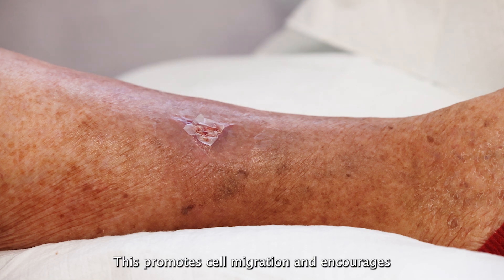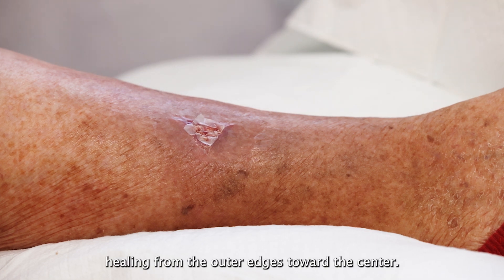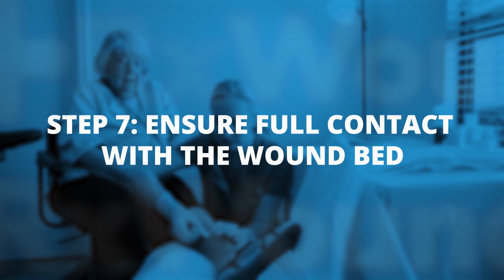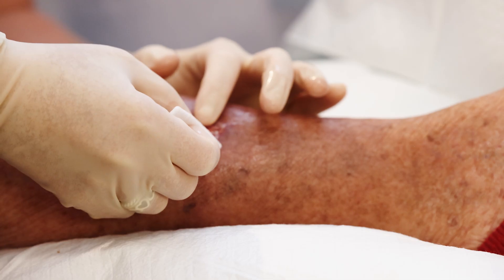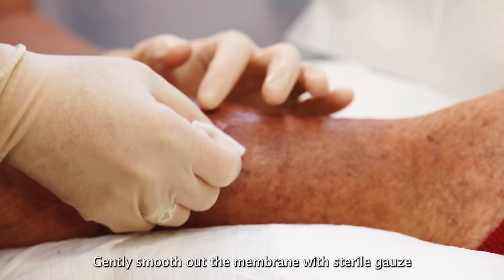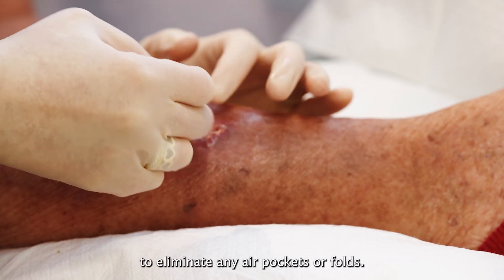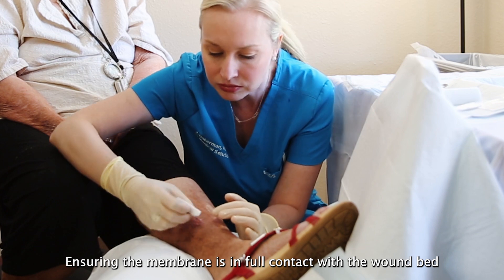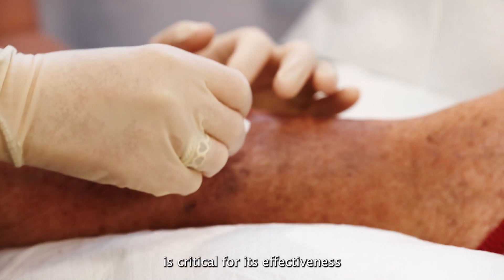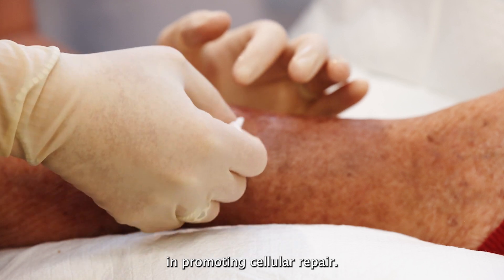This promotes cell migration and encourages healing from the outer edges towards the center. Step 7: Ensure full contact with the wound bed. Gently smooth out the membrane with sterile gauze to eliminate any air pockets or folds. Ensuring the membrane is in full contact with the wound bed is critical for its effectiveness in promoting cellular repair.